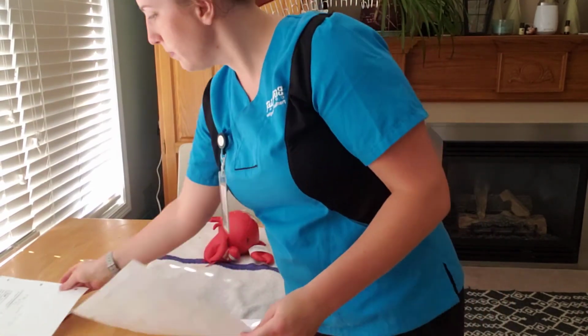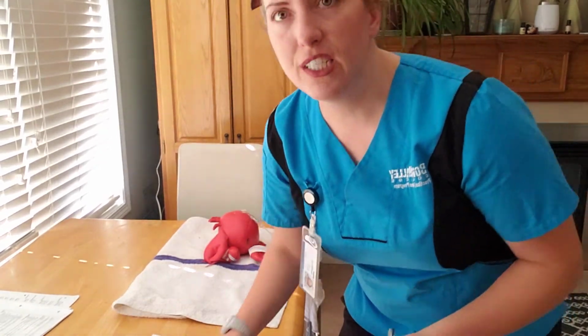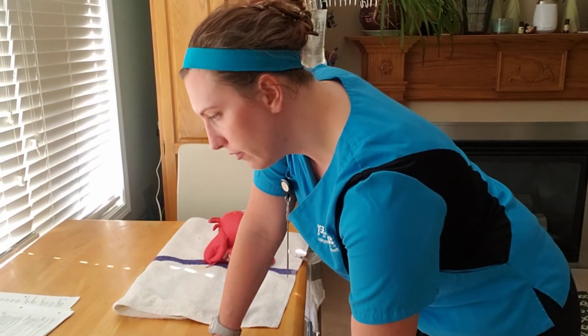Okay. So what I'm gonna do is finish my math now. So I know I have 52 milliliters of total volume. I'm gonna multiply that by 60 minutes per hour.